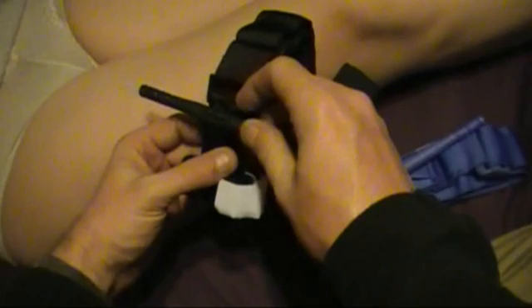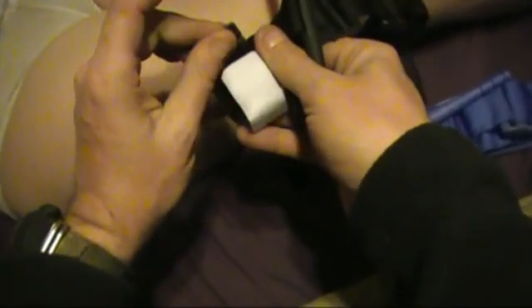This right here is your windlass. This right here is your little clippy thing for when you tighten the windlass, to slip it under. And this right here says time.